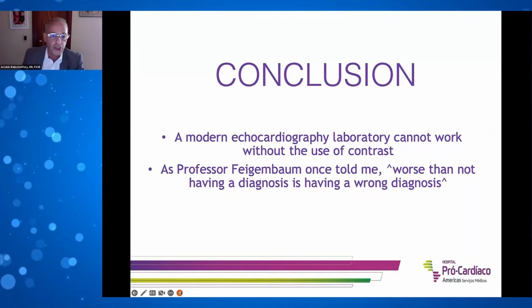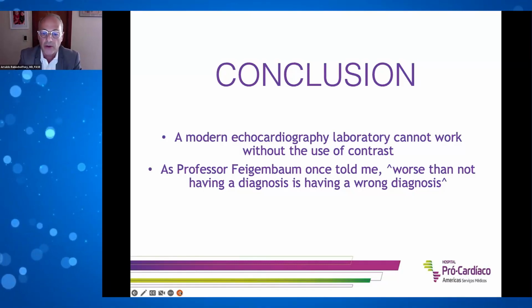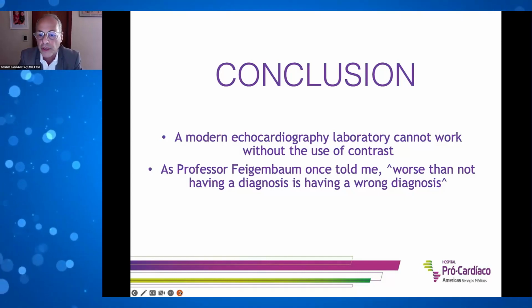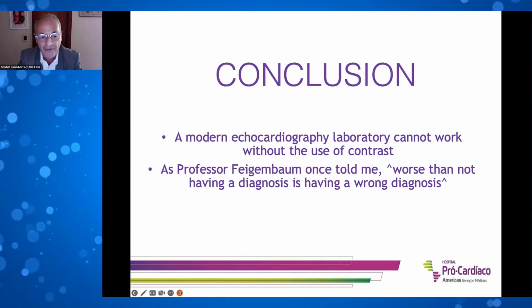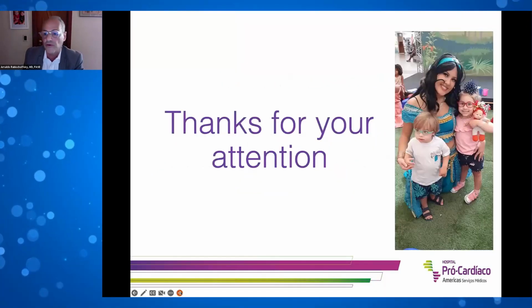So, in conclusion, a modern echocardiographic laboratory cannot work without the use of contrast. And as Professor Feigenbaum once told me, worse than not having a diagnosis is having a wrong diagnosis. Thank you for your attention.